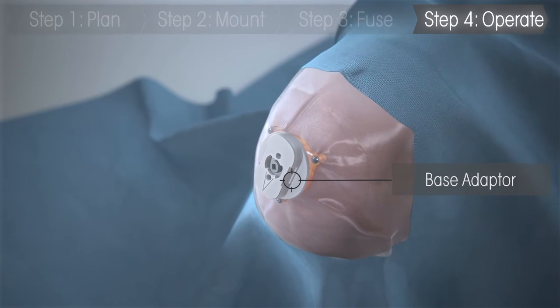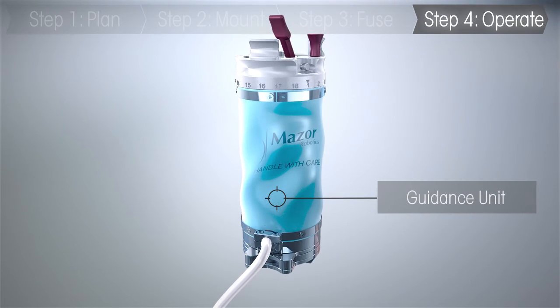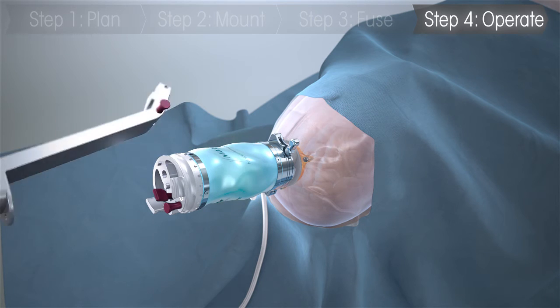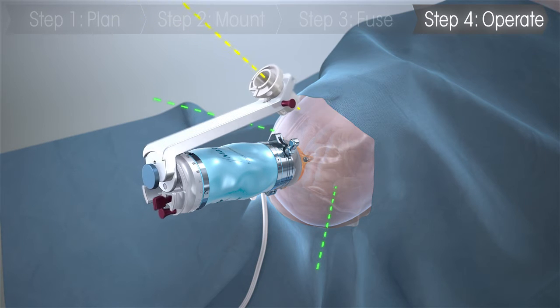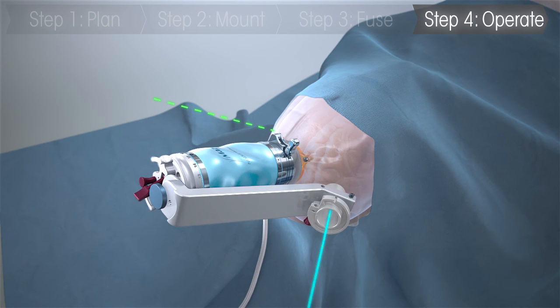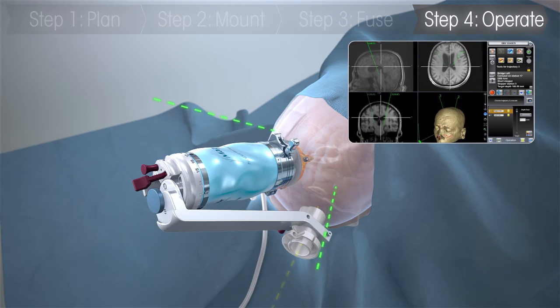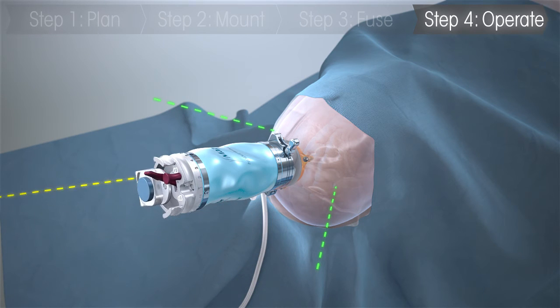After the scans are fused, the guidance unit is attached to the platform. Once mounted, the surgeon can send the guidance unit to the planned trajectories using the carousel and arm configuration with 360 degrees of working volume. Renaissance's frameless design allows for the guidance unit to easily be removed for access to the surgical site and trajectories adjusted intraoperatively if needed.